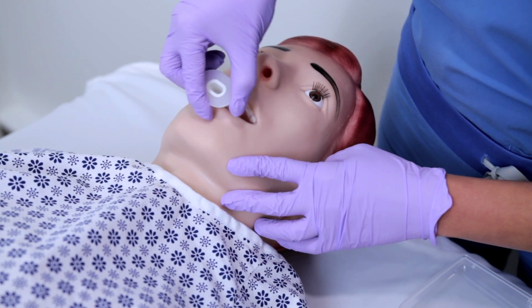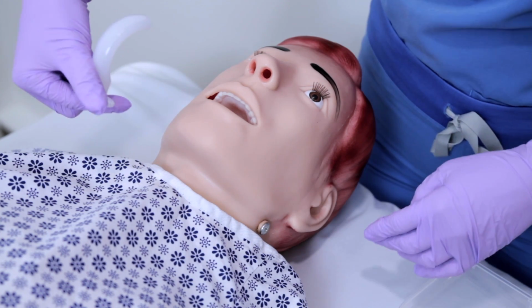When the patient is able to maintain their airway and they are meeting parameters per your hospital guidelines, you can gently remove the OPA, following the curve of the tongue, and document your assessment findings. From experience, I have noticed that when the patients begin to wake up and are meeting goals, they will begin to move the OPA with their mouth and actively swallow. This is another cue the patient is able to protect their airway. So continue to monitor the patient's hemodynamic stability and document your assessment findings.